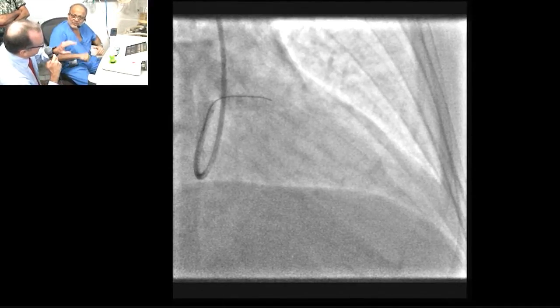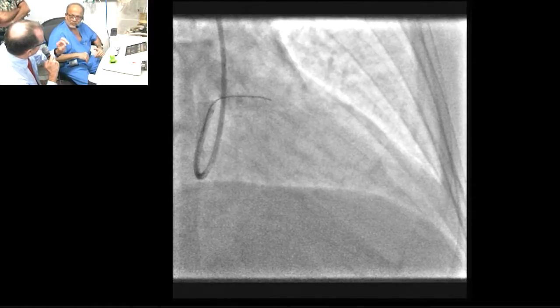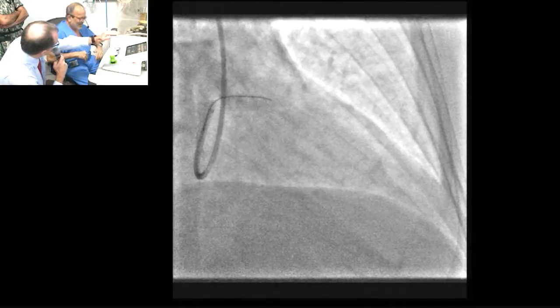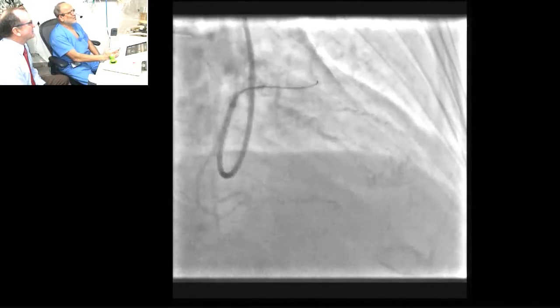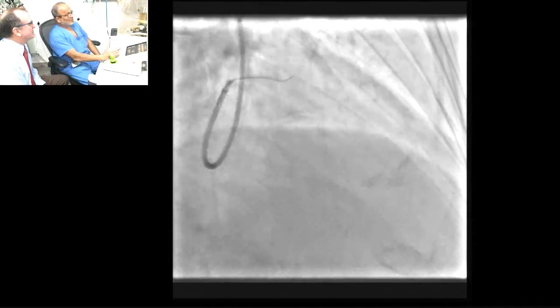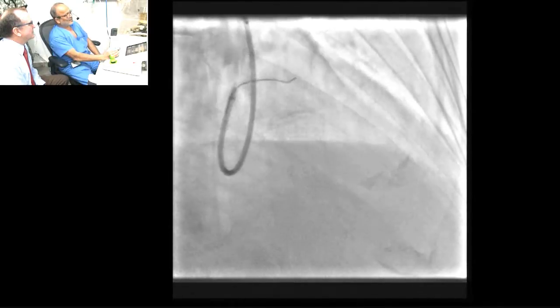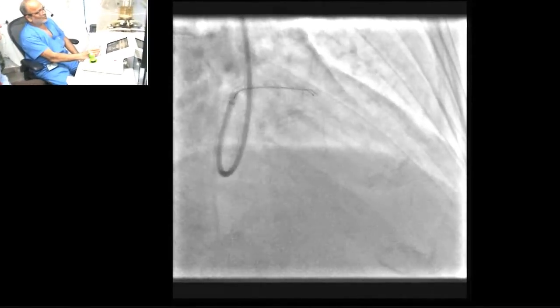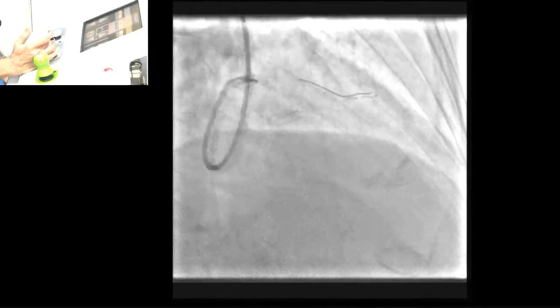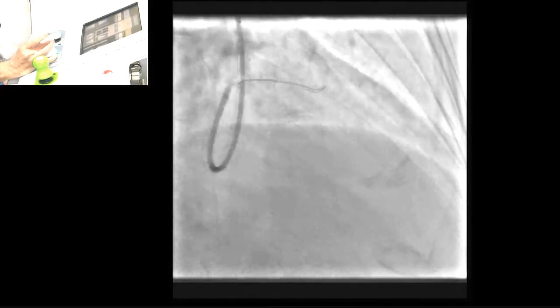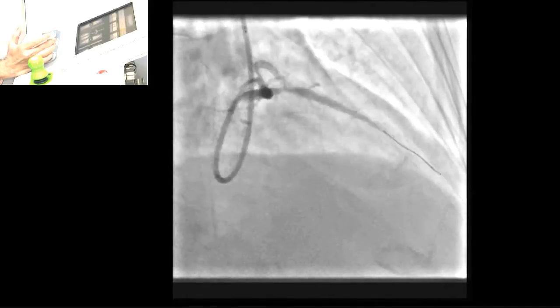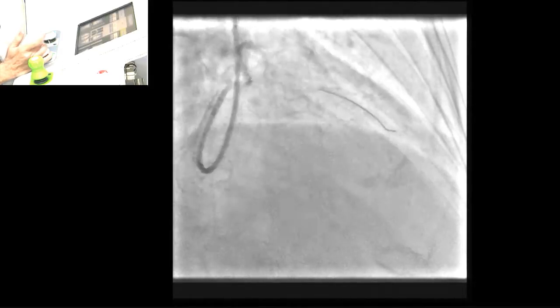In the first version there was a little bit of delay, and then you keep moving it and it has some memory and it keeps going, which could be a problem with more complex disease. The scout wire is going into the diagonal. I just go on rotating on one side — rotating only on one side — and it moves now. Scout, again going diagonal. Coming back, rotating only on one side. Should go now. Scout, again diagonal. Coming back.